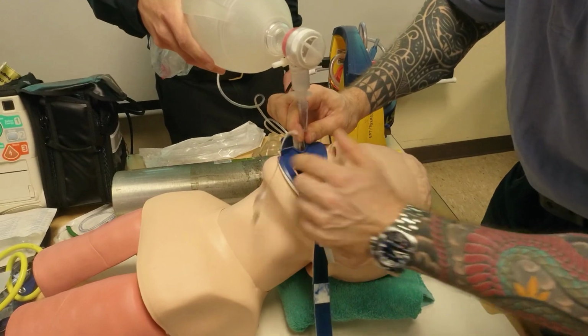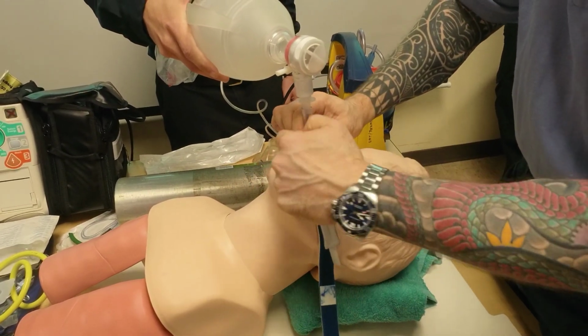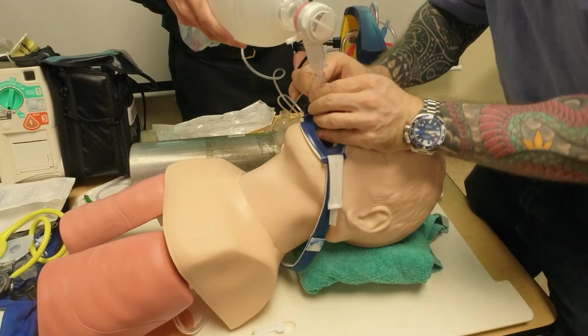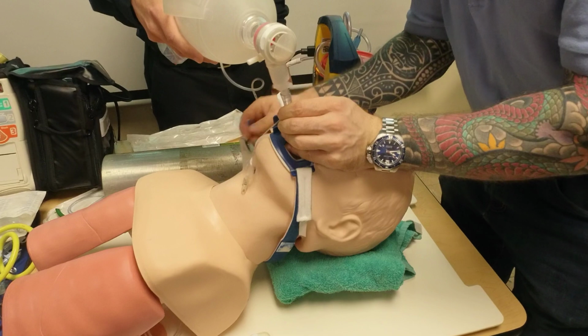This portion, this opening, has to go towards the feet, never to the top. Why? Because if I need to suction the mouth, the Yankauer has to go through this. So this part goes toward the feet. Right? Then I lace this behind the head. Where's my hand still? Did I secure the clamp? No, because I want to make sure the Velcro sits right.